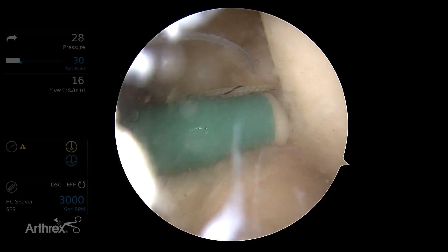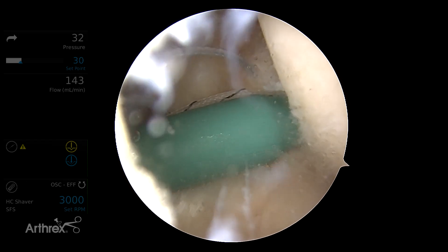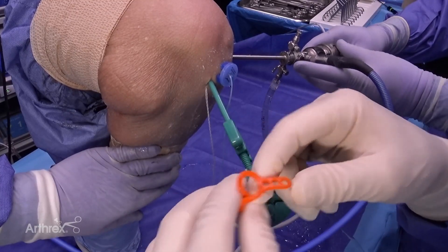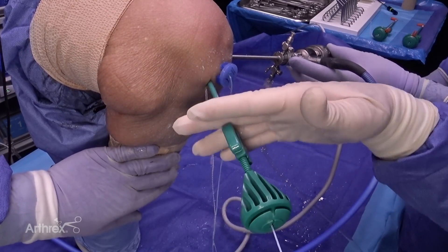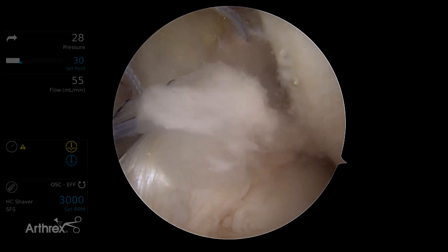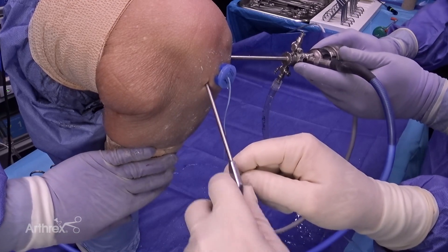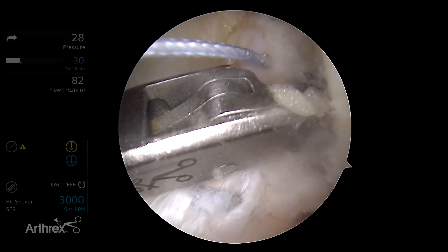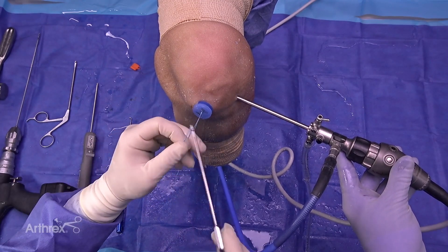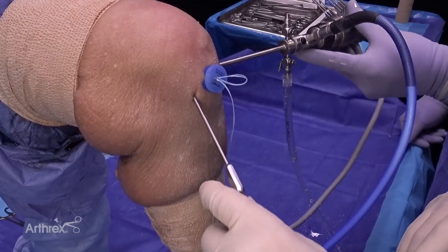You can see all of the fat bubbles in the knee, which provide the proteins we need to encourage healing. Now we can pop out the handle and take out that core stitch. We'll use the open cutter to cut that repair stitch flush up against the wall. We have our first point of fixation, and now we're going to get to the AM bundle. We're going to transfer the AM bundle sutures to the inframedial portal so we can anchor that one up.